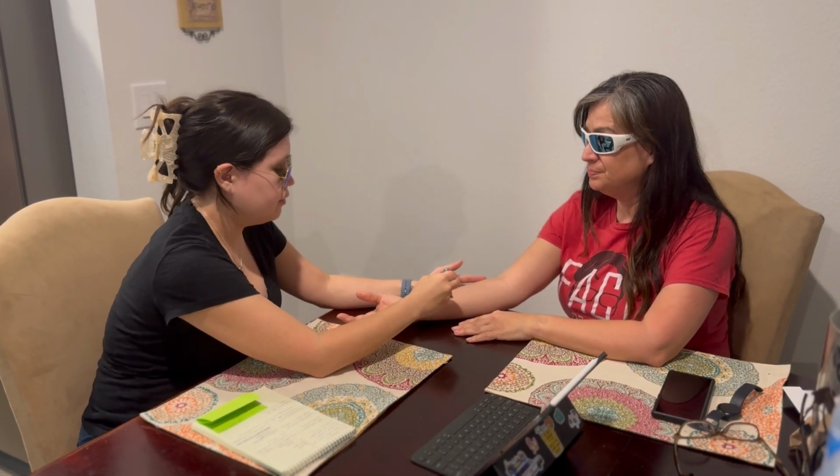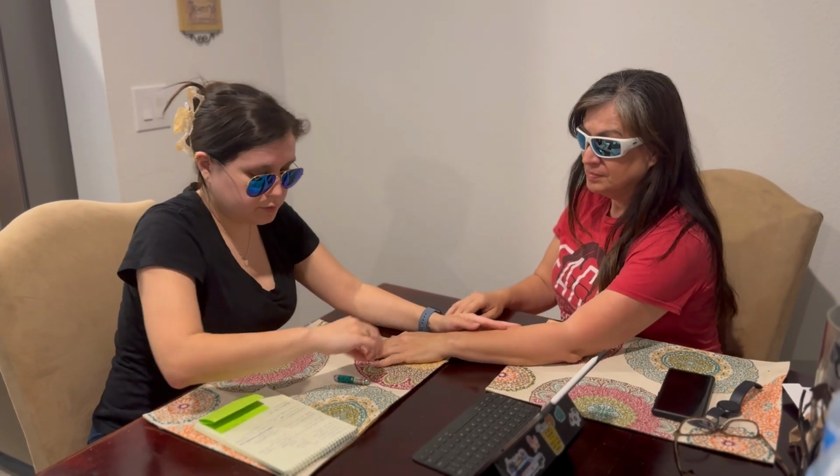All right, so it looks like we are about time to switch hands. So I'm gonna go ahead and turn this laser off, and then I'm gonna reposition you here, and we'll start on this arm.